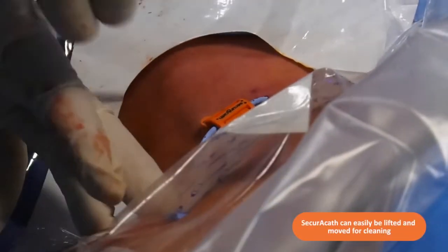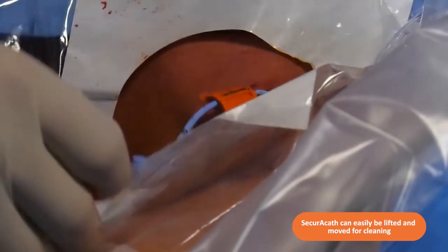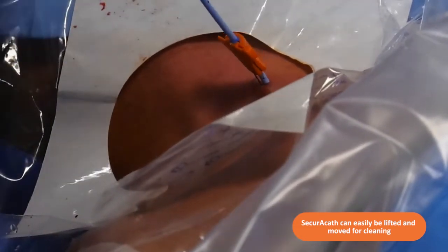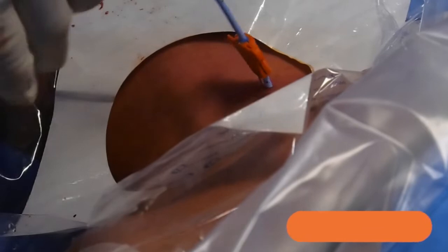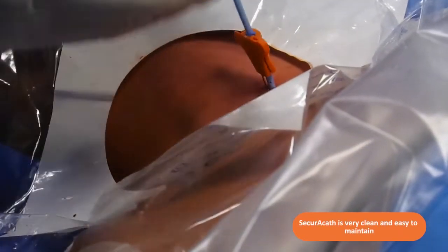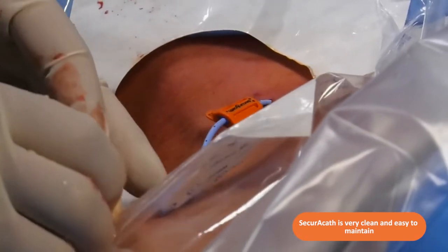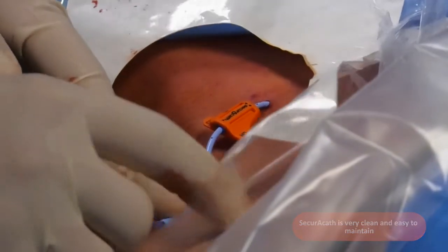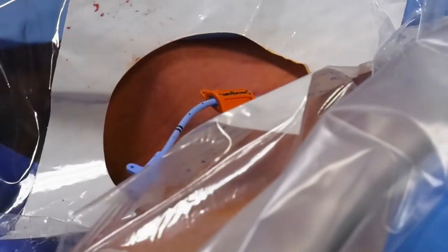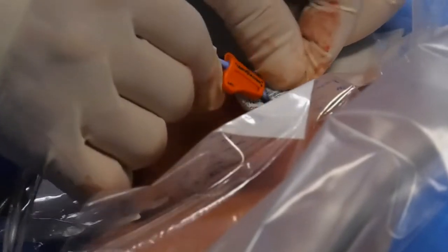The advantage of the Secura calf fixation system is that at any point during this patient's time on ITU, we can always change the dressing — we can lift this central line up and clean all the way around, getting 360-degree cleaning. It's a very neat way to secure the line without using any sutures, which usually causes a little bit of bleeding. As you can see, it's a practically bloodless procedure, very clean and very easy to maintain afterwards.